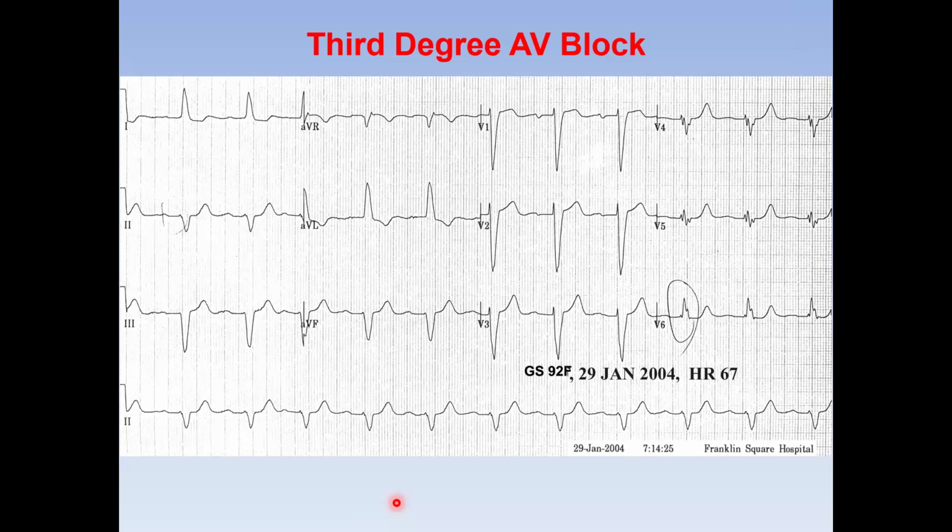Sir, can I have one question, sir? Yes, sure. I have a patient referred to me. I don't know why the Holter was done. It showed complete heart block during sleep. I don't know why the Holter was advised, but there is no symptom, and during sleep there's a complete heart block. The patient doesn't have any complaint. I have been following the patient for the last 3 years and I don't put any pacemaker. Should I continue like this?